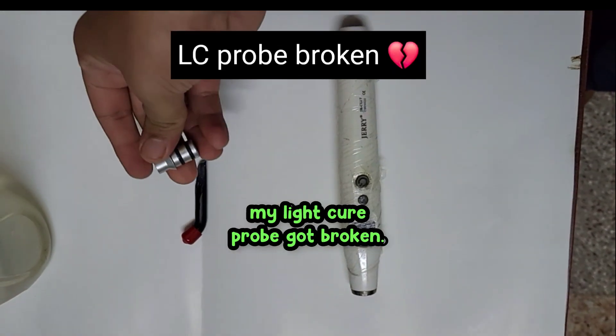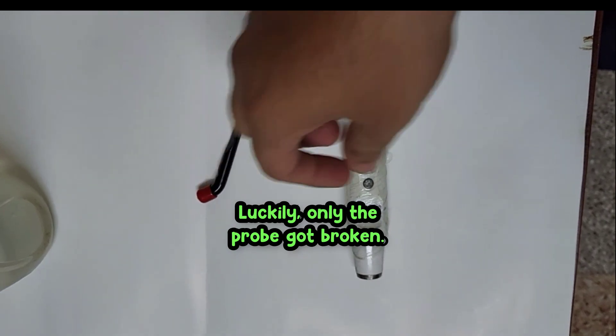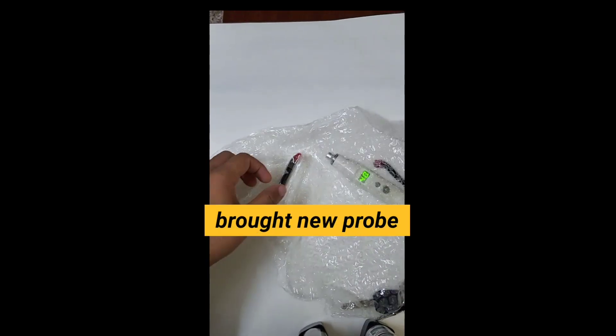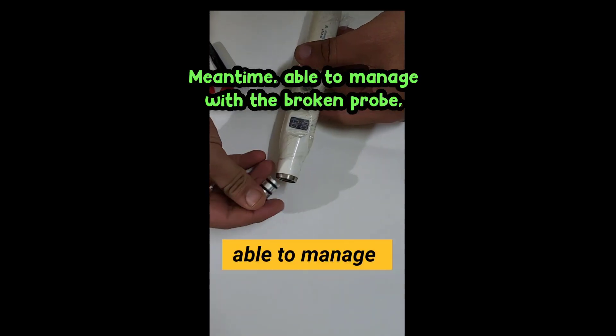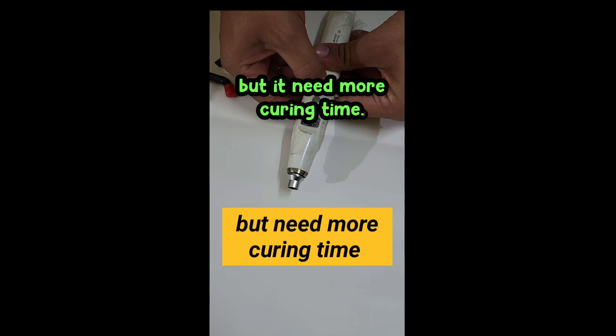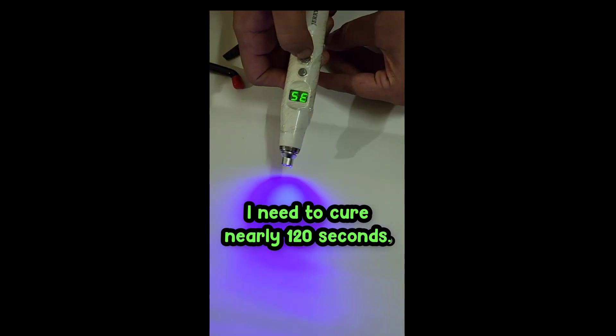Falling from the dental chair, my light cure probe got broken. Luckily, only the probe got broken. Bought a new probe from online. Meantime, able to manage with the broken probe, but it needs more curing time — I need to cure nearly 120 seconds.